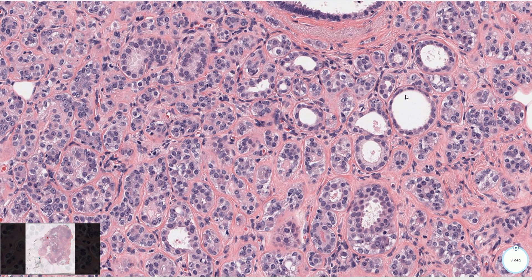We can see lumina formation at least in some parts of the tumor, which are surrounded by luminal epithelial cells with round nuclei and inconspicuous nucleoli. The myoepithelial cells are relatively prominent, which is an important morphological clue — all of these cells with clear cytoplasm are myoepithelial cells.